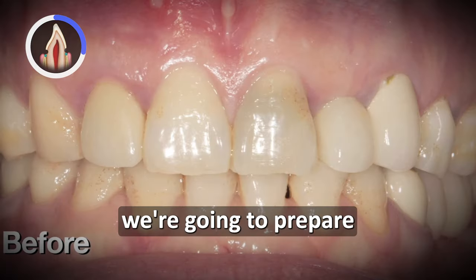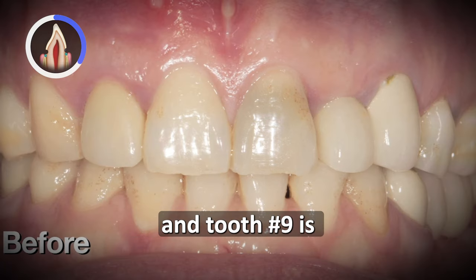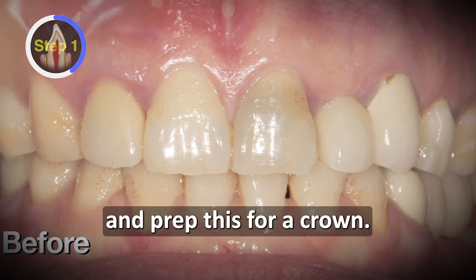For this case we're gonna prep tooth number nine using this technique. Tooth number nine is an endodontically treated tooth with some old failing composites and an approximal, so we're gonna go ahead and prep this for a crown.